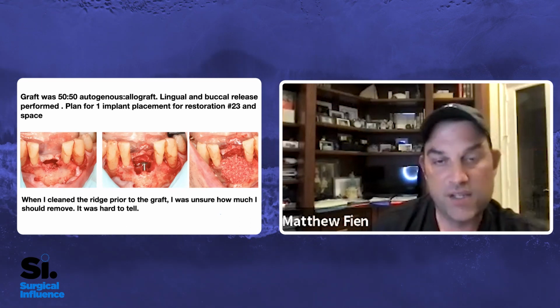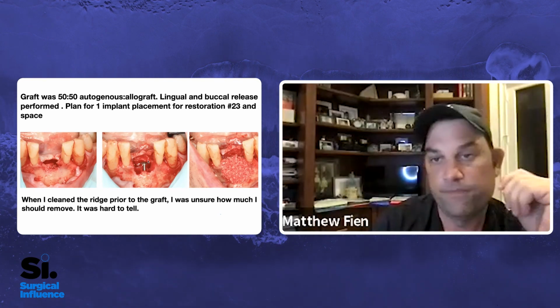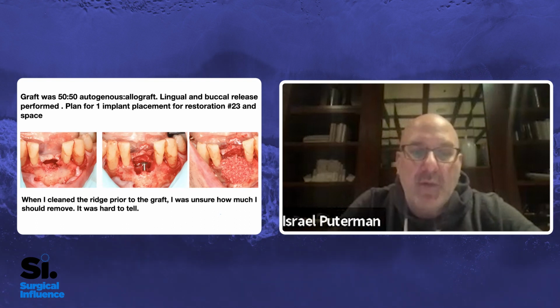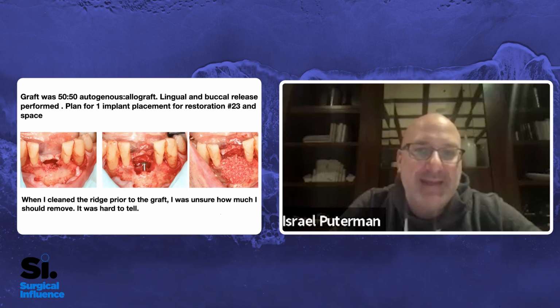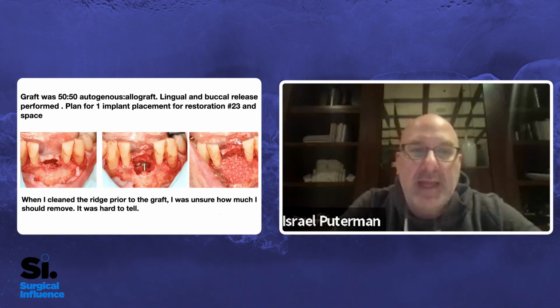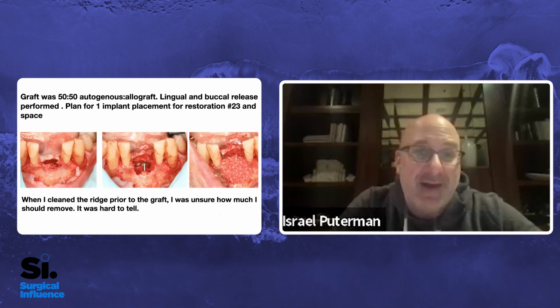I noticed here, this is a true tenting screw. It doesn't have threads all the way up. Yeah. You like to use the threaded tenting screws most of the time, right? I do. Honestly, when I've used tenting screws, I've actually had them break sometimes, where they break at the junction of the threaded and the lag portion of the screw. I've had them snap right at that spot as I'm screwing it in, and I've not had a full threaded fixation screw snap like that. So that's what I use.